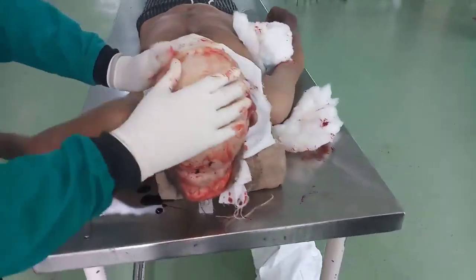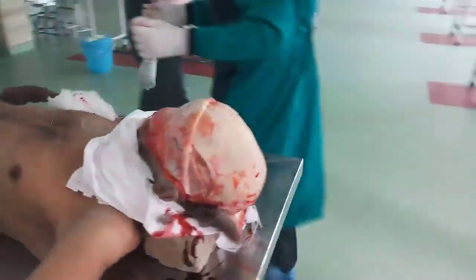Okay. Now next part, we have to open the skull cap or the vault of the skull. For that, first we will make an outline.